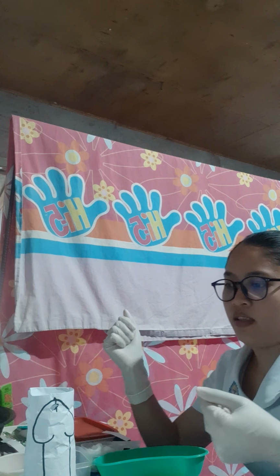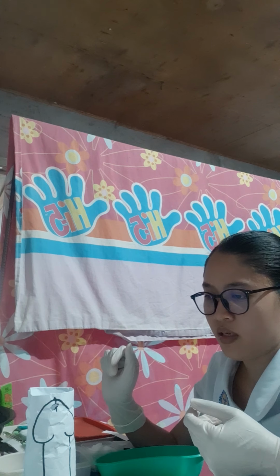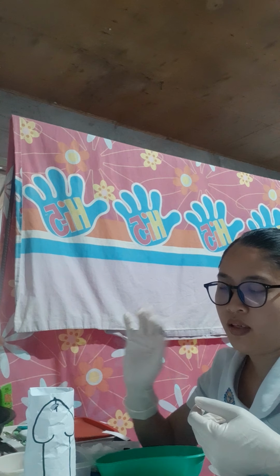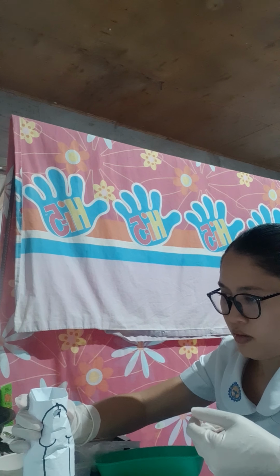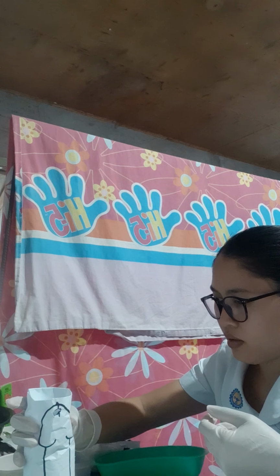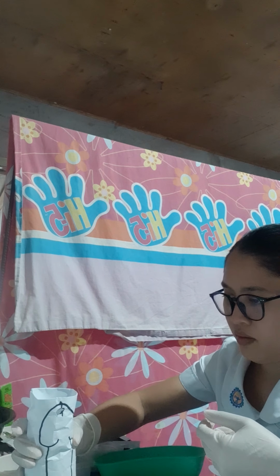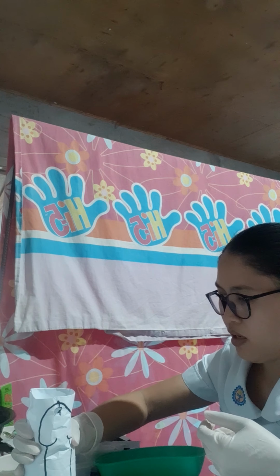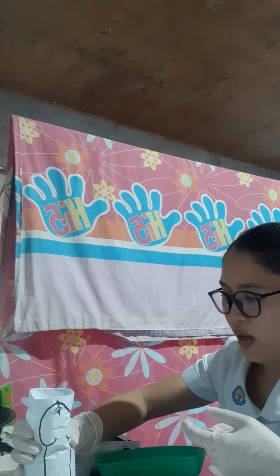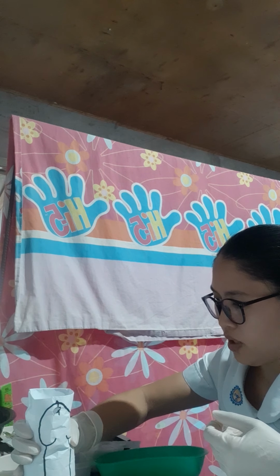If the patient is not circumcised, we're going to retract the foreskin with the non-dominant hand. Then grasp the penis at the shaft just below the glans. Retract the urethral meatus between thumb and forefinger. We are going to maintain this position throughout the procedure.